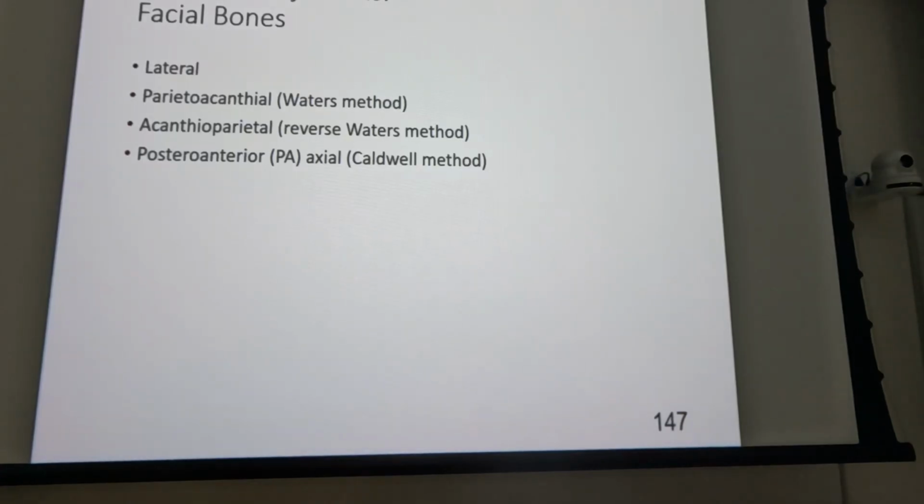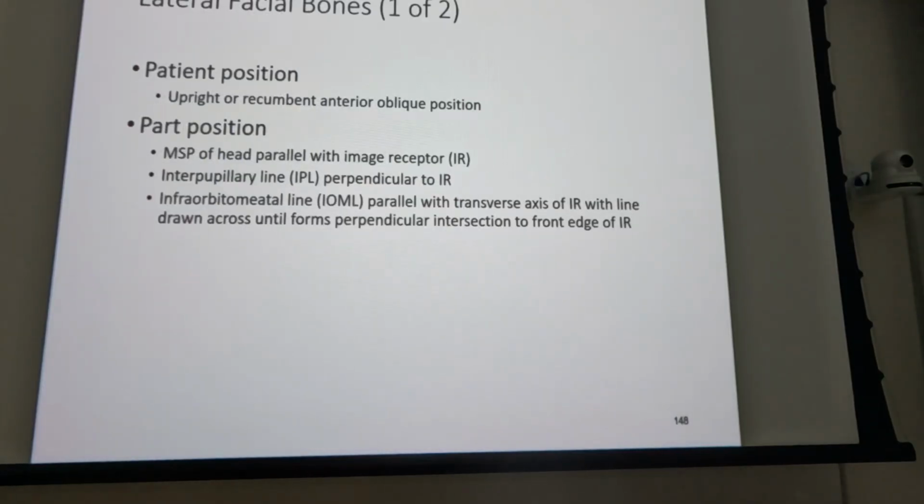The Waters is, in my opinion, maybe the most diagnostic image of the skull, and one of the very few that we should actually still be doing. Caldwell, whatever. PA, nah. Towns, maybe if we suspect a basilar skull fracture. Aside from that, just in that one case. But the Waters, we can diagnose a lot of stuff just off the Waters. We're going to take a look at those. You know I got opinions on just about everything, right?